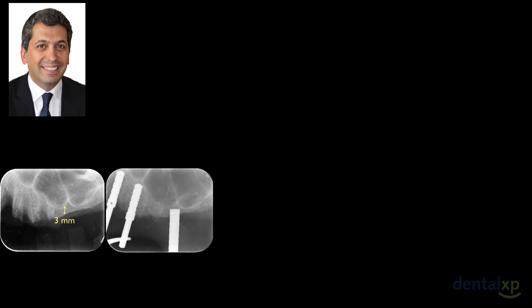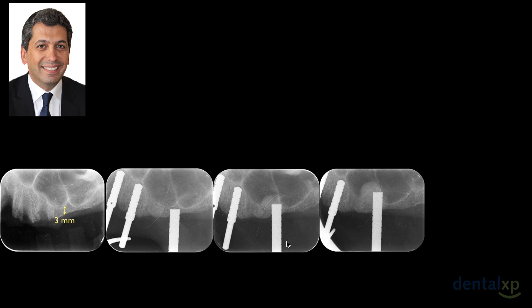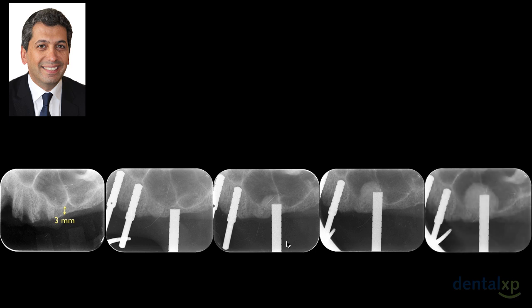In other cases where we have, in this case, 3 millimeters with a septum, you see that when I started my elevation, bone was going mesially to the septum, which is normal. And then I kept going up. And it's nice to see that at a certain point, the septum broke, or maybe the graft went behind the septum, and we could have a very nice dome radiographic shape of the graft with the osteotomes. And we could predictably go from 3 millimeters to 12 millimeters.